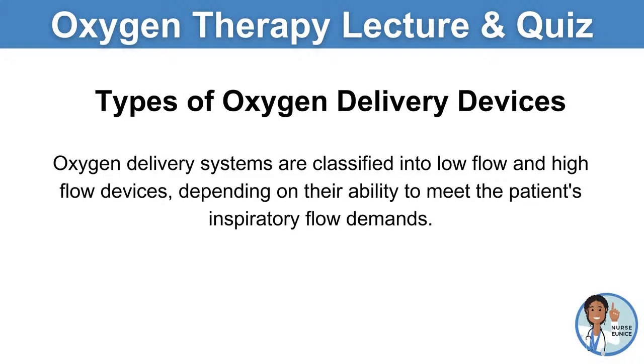And now we get to the different types of oxygen delivery devices. For those of you who are just tuning in, we just talked about some of the reasons that a patient may need oxygen. Now we'll talk about the different devices. And at the very end, we'll do a practice quiz. I won't be able to monitor the chat until I get through with the lecture.